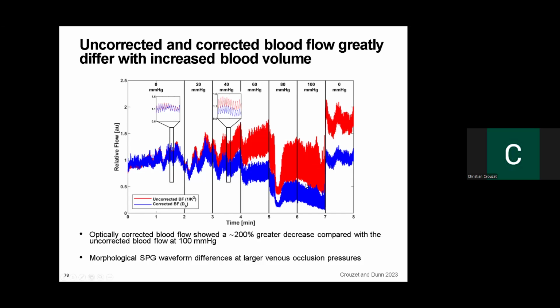Sure, basically looking at this amplitude, right? Yeah. So that's where, for me, originally when I was going into this, I thought that 100 millimeters of mercury on the arm cuff, I'd actually originally thought the amplitude would be smaller because you're cutting off some flow, but maybe that's not the case. And there are techniques on the finger to get non-invasive blood pressure where they actually will tighten up, and they're using that information to get their blood pressure. It's basically like a small blood pressure cuff on the finger. So that could effectively be what this is.